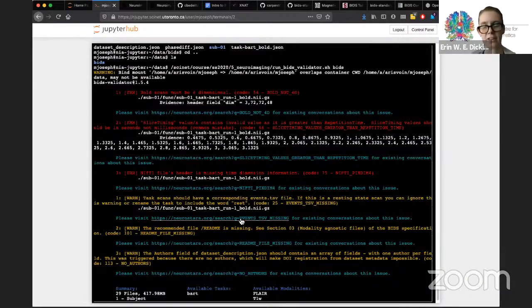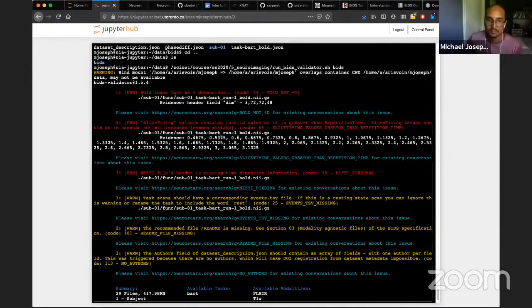Yeah, it's an area of controversy whether or not slice timing correction actually does anything. But the key here is that if you want slice timing correction to run in a BIDS preprocessing pipeline, then you need this slice timing field to be correct within the JSON. It's not something you can edit and add elsewhere, I guess is all I'm going to say.